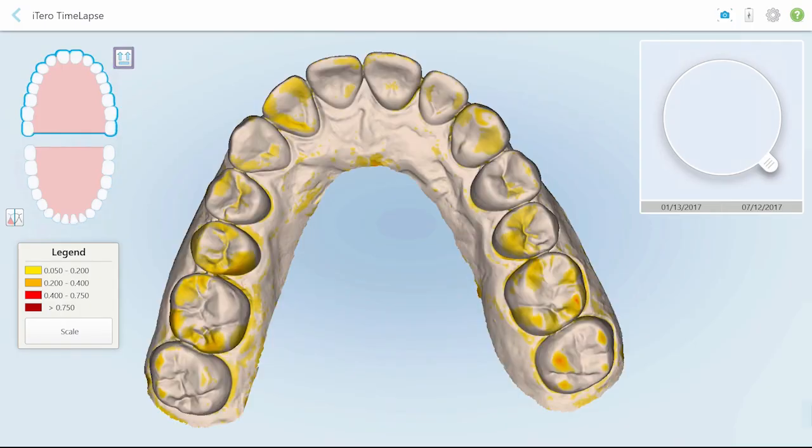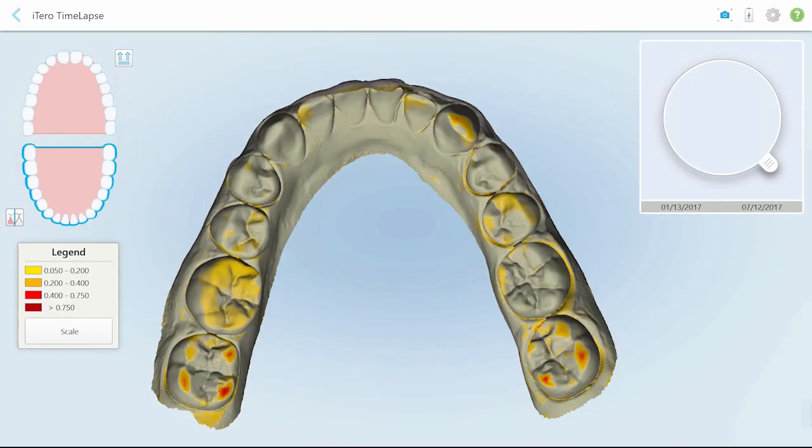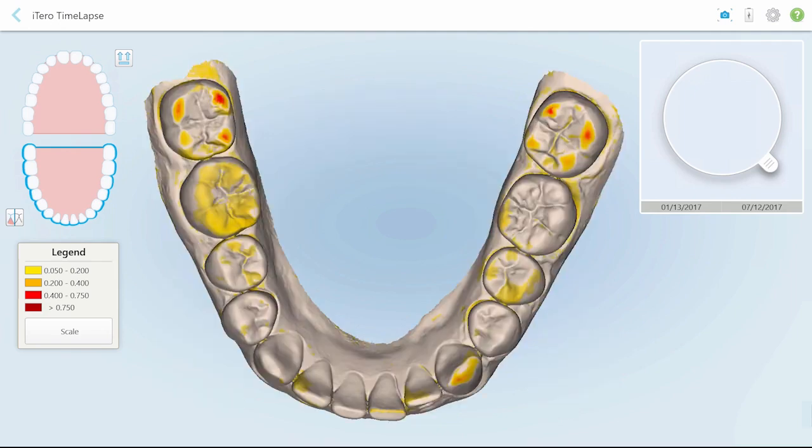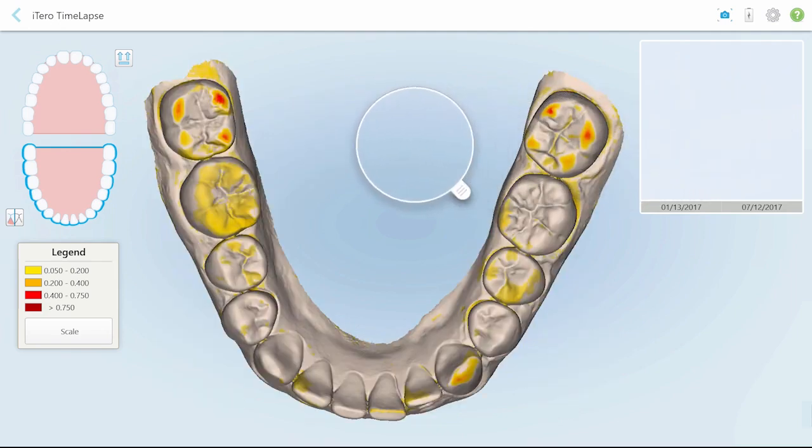Drag the model in any direction to display the desired angle. Finally, tap the arrows button to return to the default occlusal view. Note that only one arch can be viewed at a time.